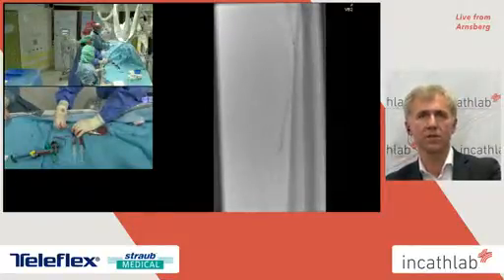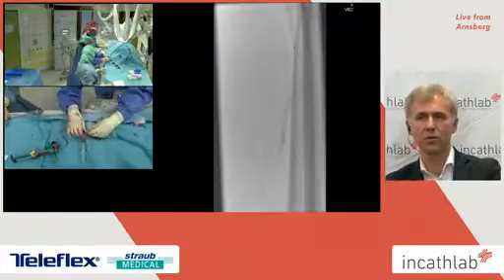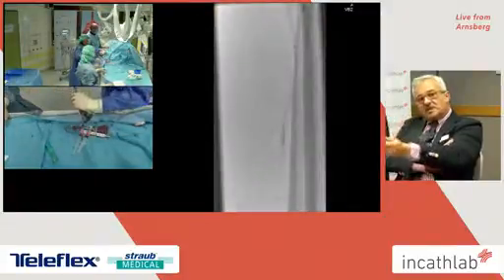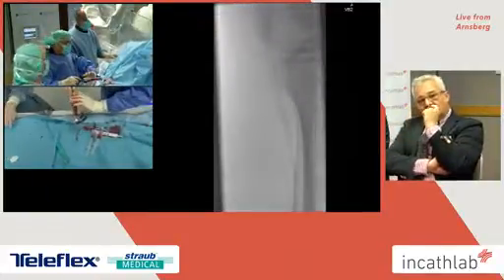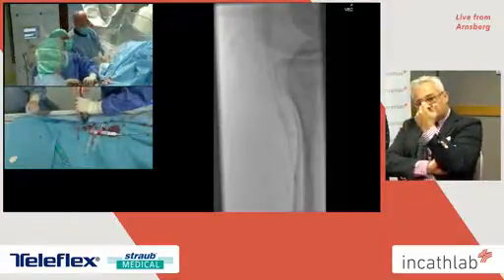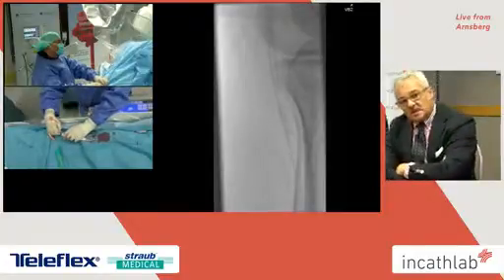So that's the advantage of this short balloon, that you can stay super selective and you're not filling collaterals. And of course there is no need to remove the wire to check through the balloon, because we have this particular mechanism of opening and closing the valve, and this could really be an advantage during this kind of procedure.